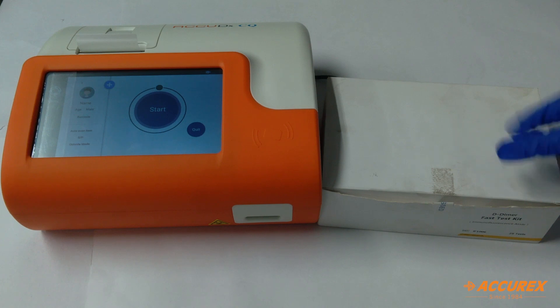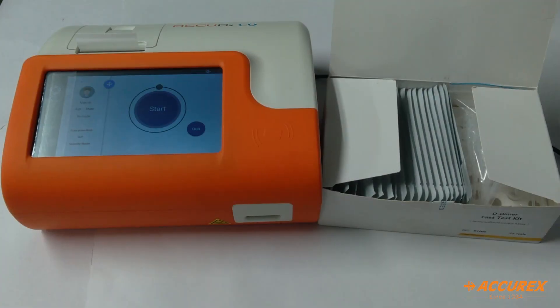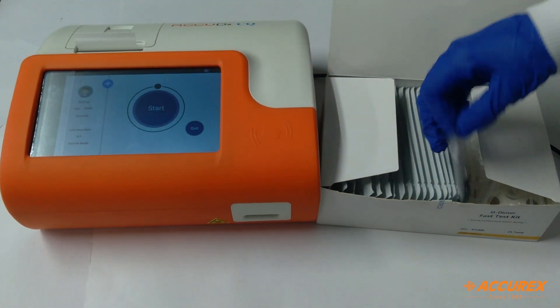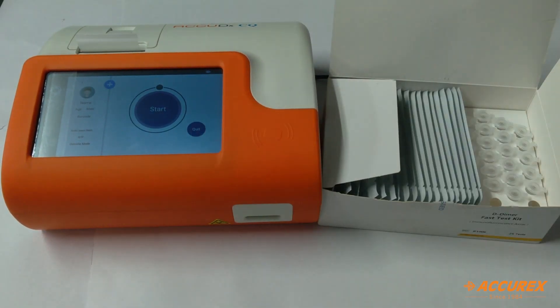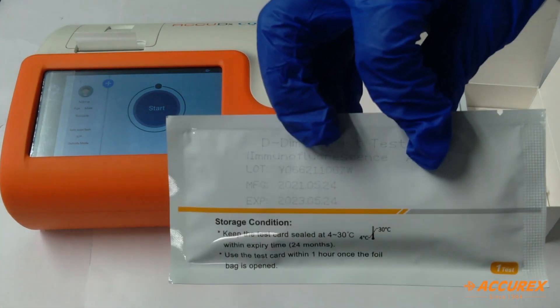First we'll see all the contents of this kit. There is one pack insert, one SD card, these are the reusable pipettes, and this is the test strip.